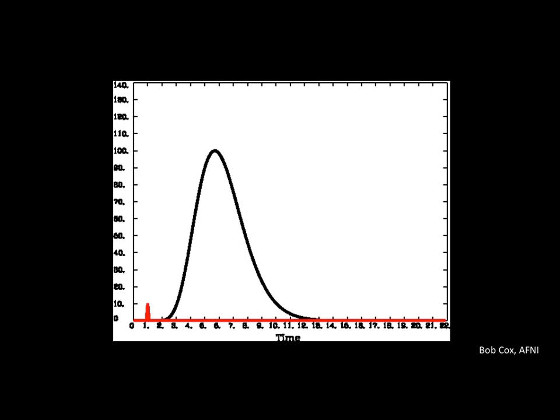It's simple to use. We're estimating a single parameter, and it makes all of our computations a lot easier. You could do something more complicated. You could try to make your own. You could try to, by subject, derive what seems to be their idiosyncratic BOLD response and use that as a basis function. That's all open to you. But for the purposes of what we're doing today and for what most people do, they just use this HRF.